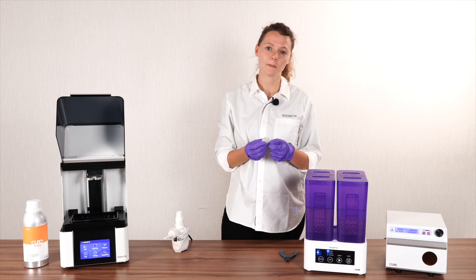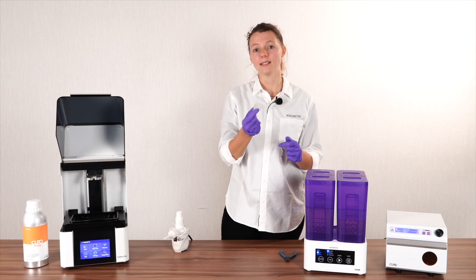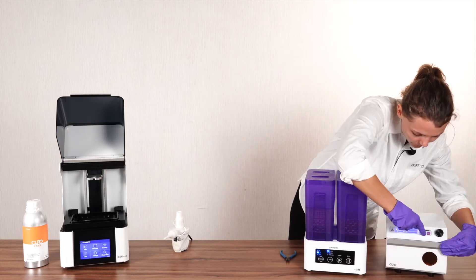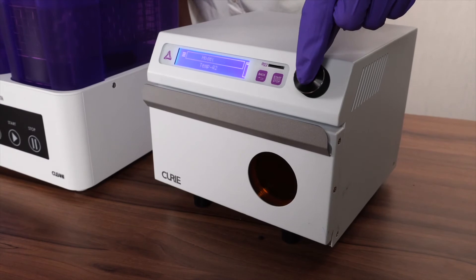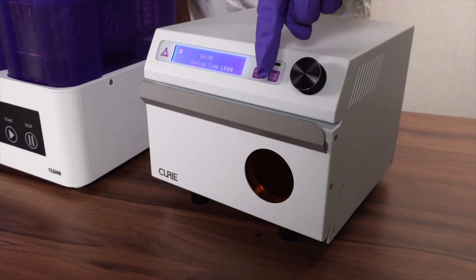Once your 3D print is all dried, place it inside the UV oven. This step is essential to make sure that all resin is entirely polymerized and it's safe for intraoral use. In the oven, pick the material library curing option and then select your resin — in this case, we use Guide.